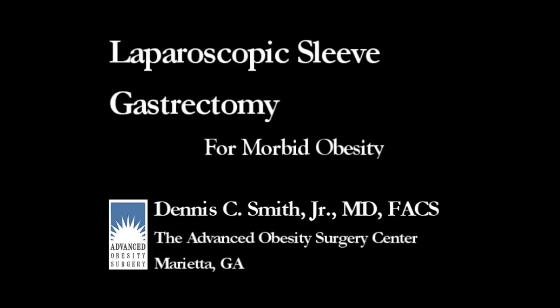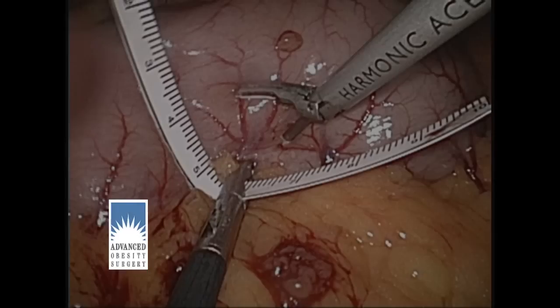I'm Dr. Smith and this is our technique for the laparoscopic sleeve gastrectomy. First, we need to take down the blood supply to the lateral edge of the stomach. We start by measuring six centimeters from the pyloric valve along the lateral edge of the stomach and making a mark with a harmonic scalpel so we can find this spot later.